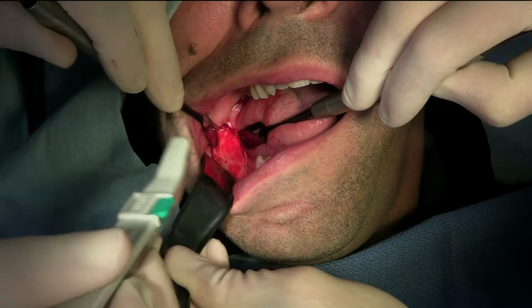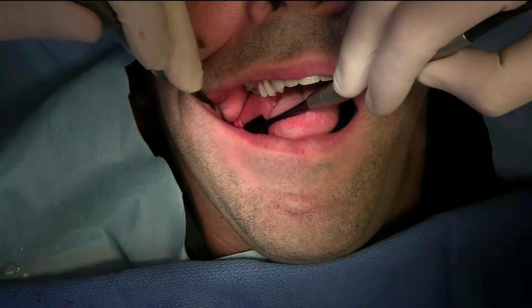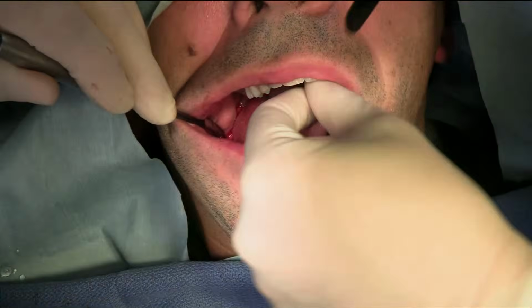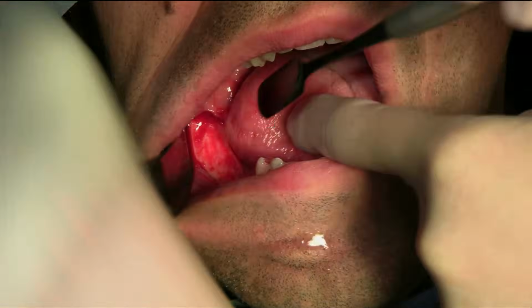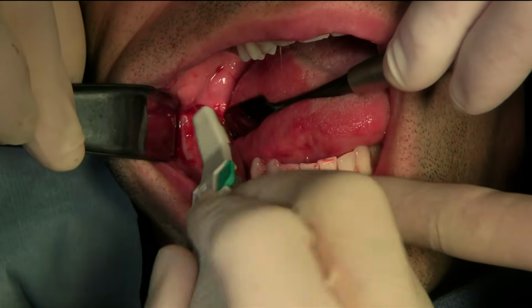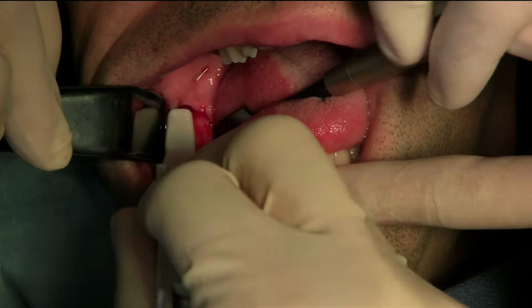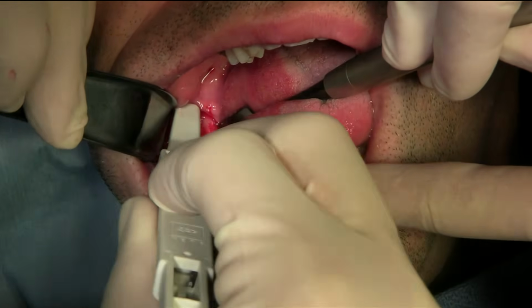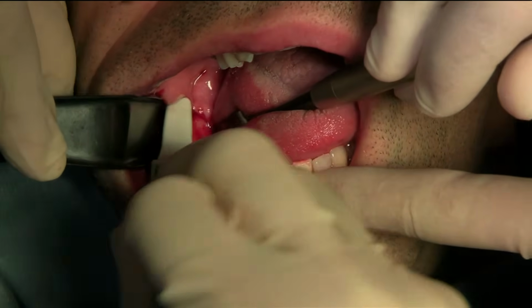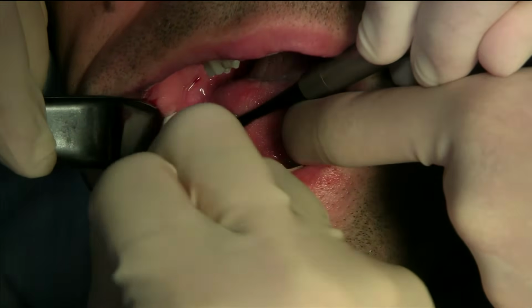Okay, I need to get in here, so maybe even that bite block needs to be removed so I can close a little bit. Ready to get him out? Yeah. Let me touch him for you a little bit. Okay, open. Okay. So this is the largest scraper. And can you remove what's holding me back here? Just a lot of pressure, Mohammed. Suction there.